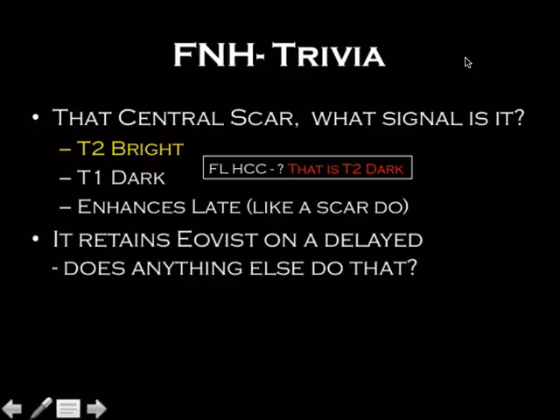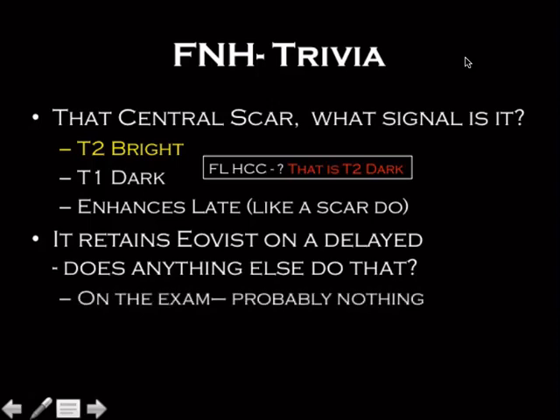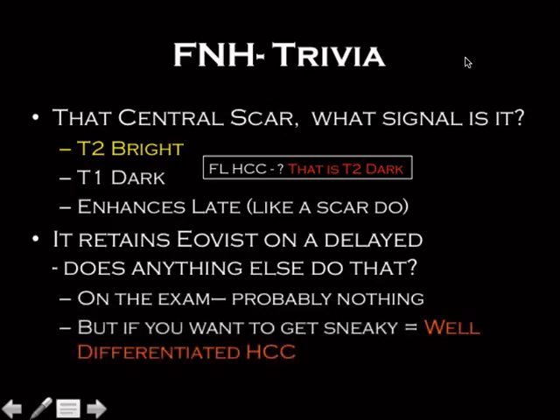And at one point in my life, I thought that this was the only thing that did that, which isn't actually true. But on the exam probably is. So delayed Eovist is confirmatory for an FNH. Just put that in your head and that will be fine. But know that a well-differentiated HCC can do that as well.